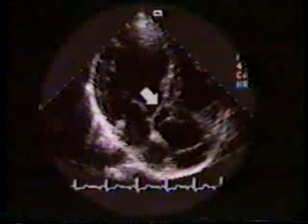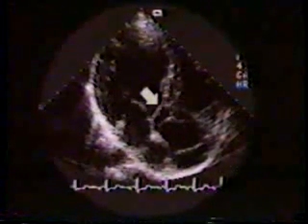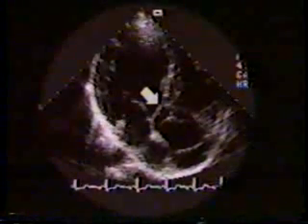This is an apical long axis view of another patient. In this 28-year-old patient, the membrane could not be well seen in the parasternal long axis view. Note there is concentric left ventricular hypertrophy present and the discrete membrane is clearly visualized. Color flow examination shows a mosaic color jet in the left ventricular outflow tract extending up to the aortic valve. In real time, you can clearly see this eccentric jet and also note absence of aortic regurgitation in this patient.